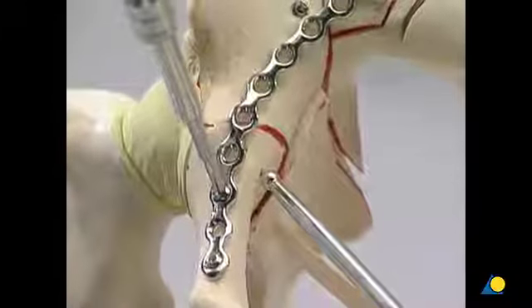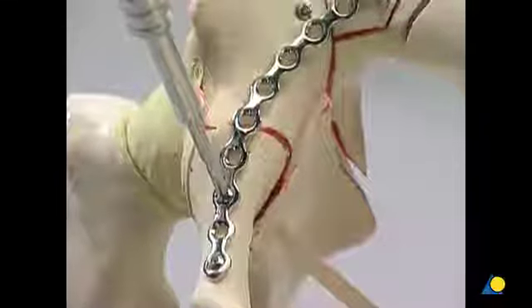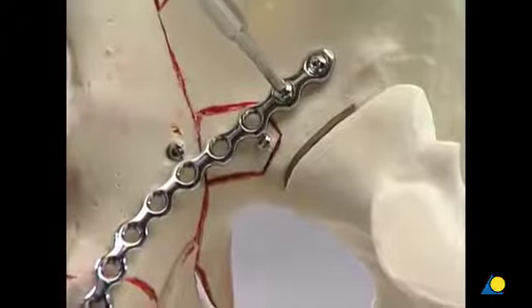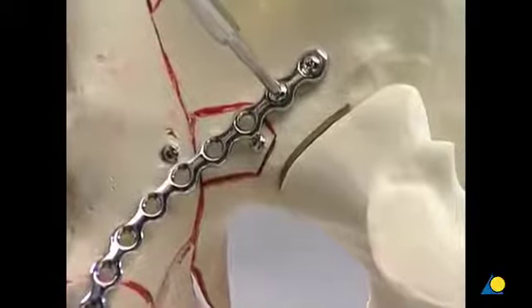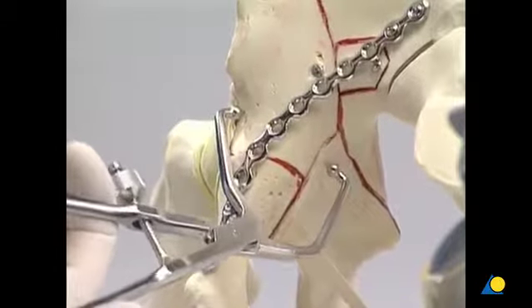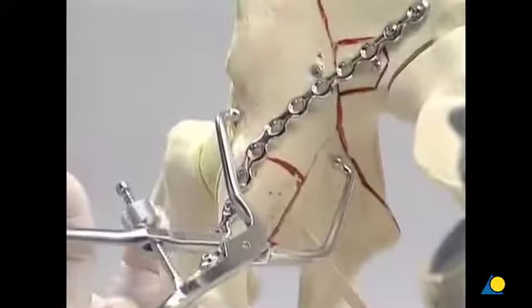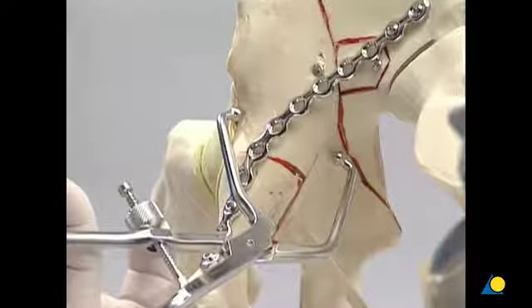The ball spike is introduced to help improve the position of the anterior column fracture components, and a screw is inserted through the third distal plate hole. A second screw is placed in the proximal end of the plate. The large angled reduction forceps is introduced. In this situation, the short arm is placed through the second window and the long arm through the third window. The forceps is applied from the pelvic brim to the quadrilateral surface. The posterior column is reduced to its correct position.